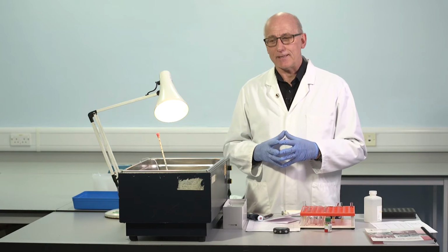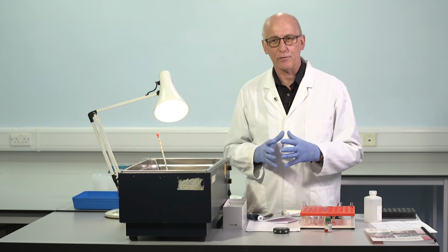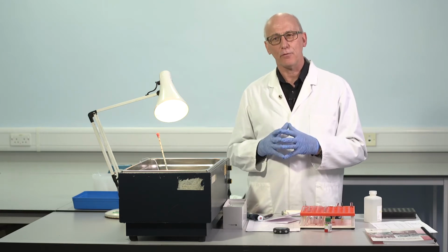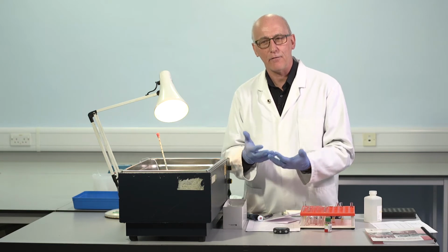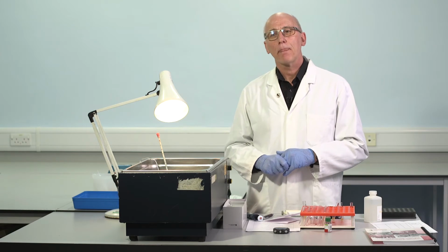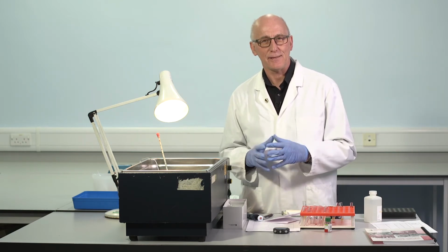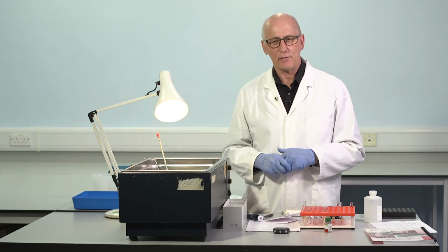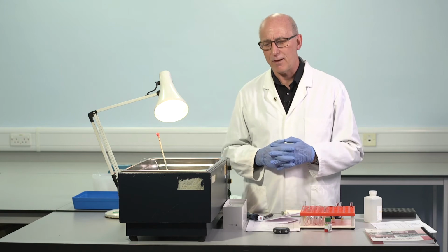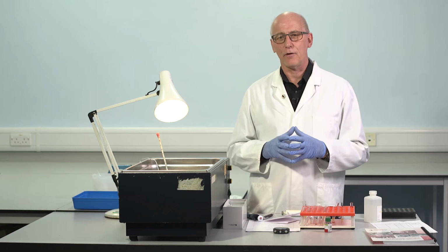Different phospholipids present in the various reagents. For most samples, of course this will have some impact on the clotting time we obtain, but for most samples, when we convert clotting times into factor VIII activity, we'll see that shortly, then we obtain the same answer, irrespective of which APTT reagent is used. The vast majority of samples, normal subjects, most patients with von Willebrand's disease, haemophilia and so on. But of course there are different phospholipids in the reagent, so there is the potential for a different result.